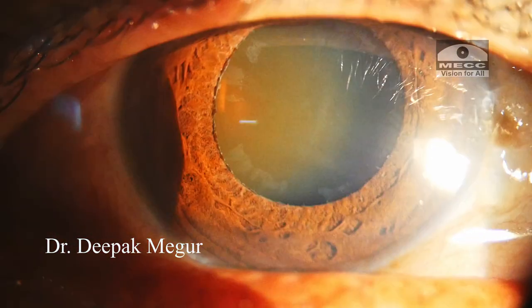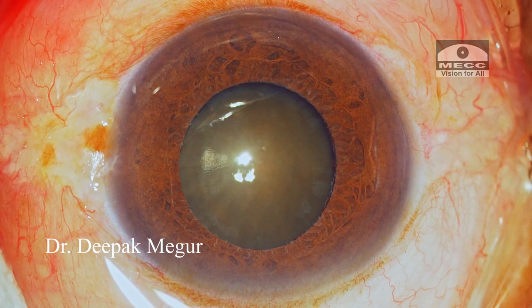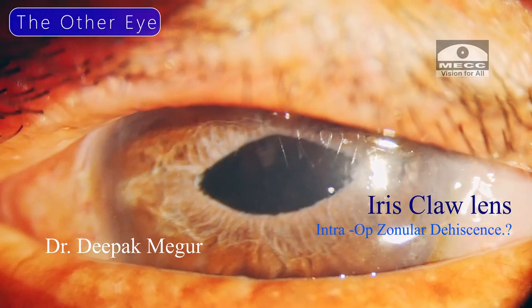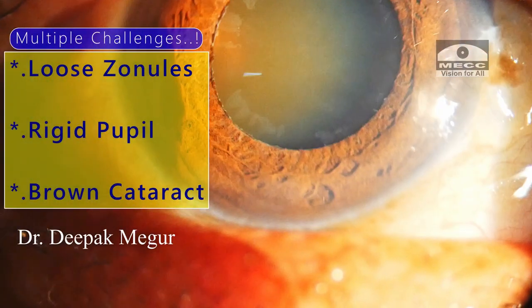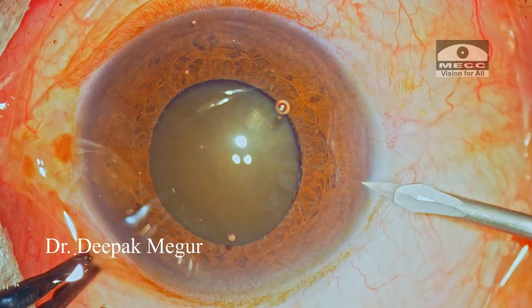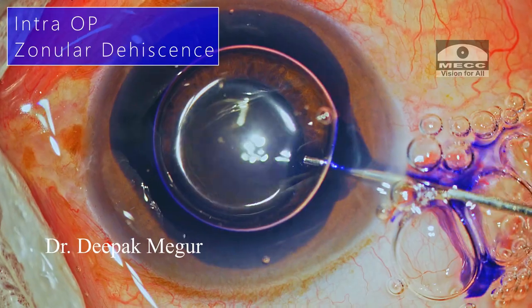This man has phacodonesis because of zonular weakness and was referred to me by my friend who was going to do the surgery but had a change of plan after doing the incision. You can see this is the incision site. The other eye was operated elsewhere a year back, which turned out to be an intracapsular extraction with an iris claw lens, and the visual outcome was okay but not great. I have multiple challenges: loose zonules, a moderately dilating pupil, and a brown cataract. The most important anticipated intraoperative complication I'm concerned about is intraoperative worsening of the zonular weakness during surgery, leading to inability to salvage the bag.